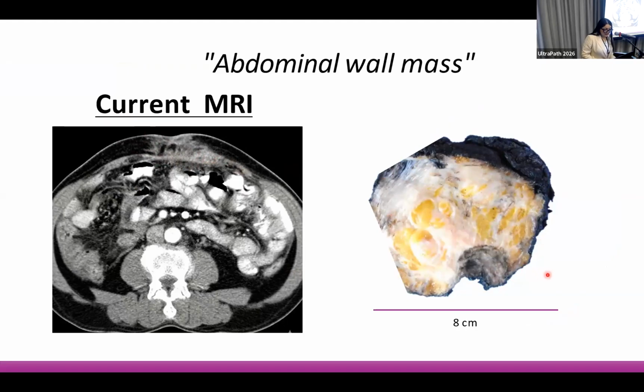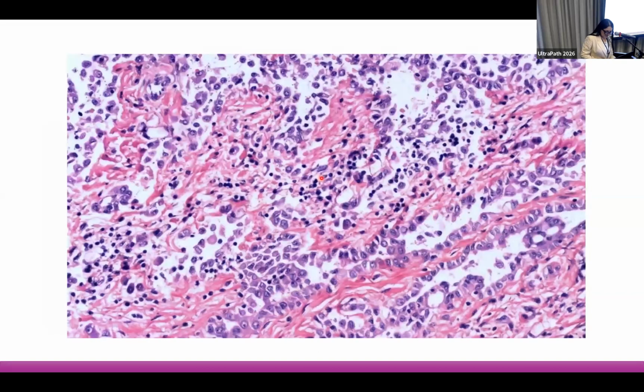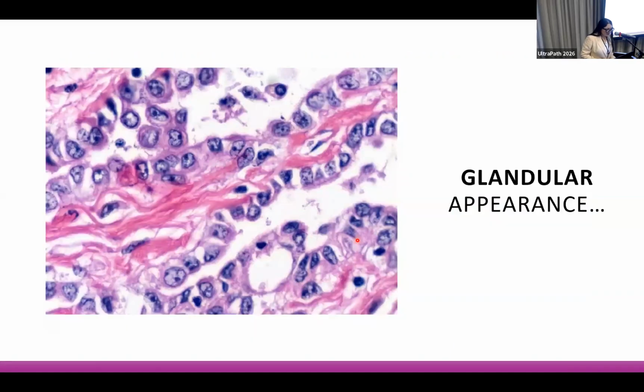And we received this specimen. We can see the adipose tissue alternating with fibrous areas with increased consistency. At the sections, there are neoplasms with a glandular appearance exposed in these patterns, and at higher magnification, it presents cilia on the surface, in the luminal part, and with some glandular appearance.